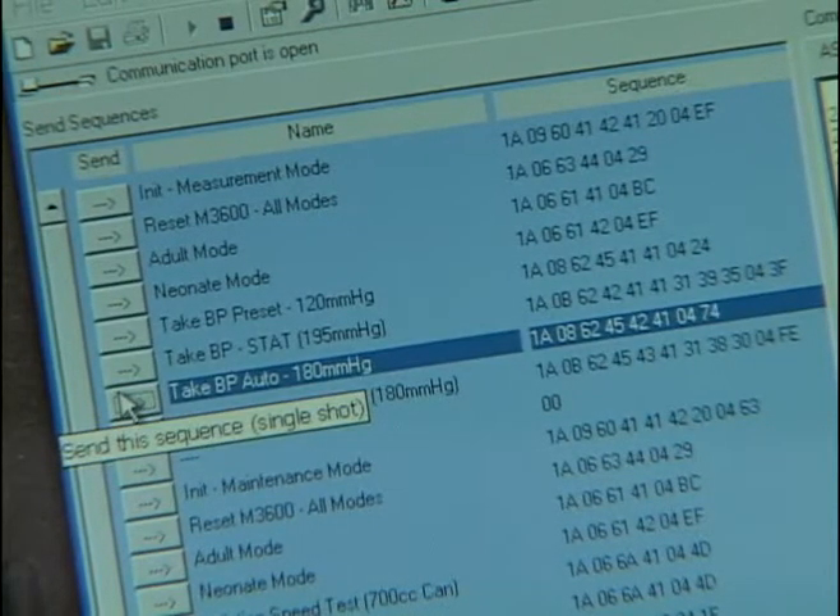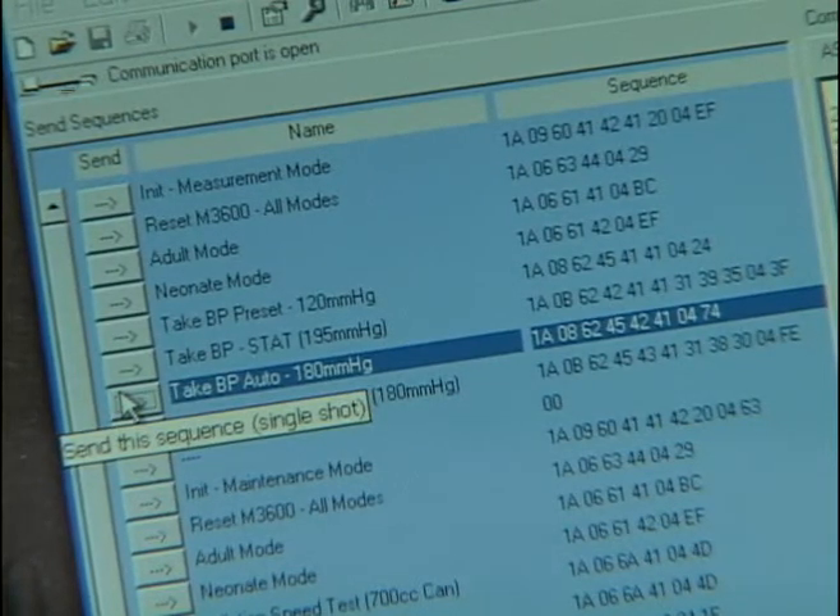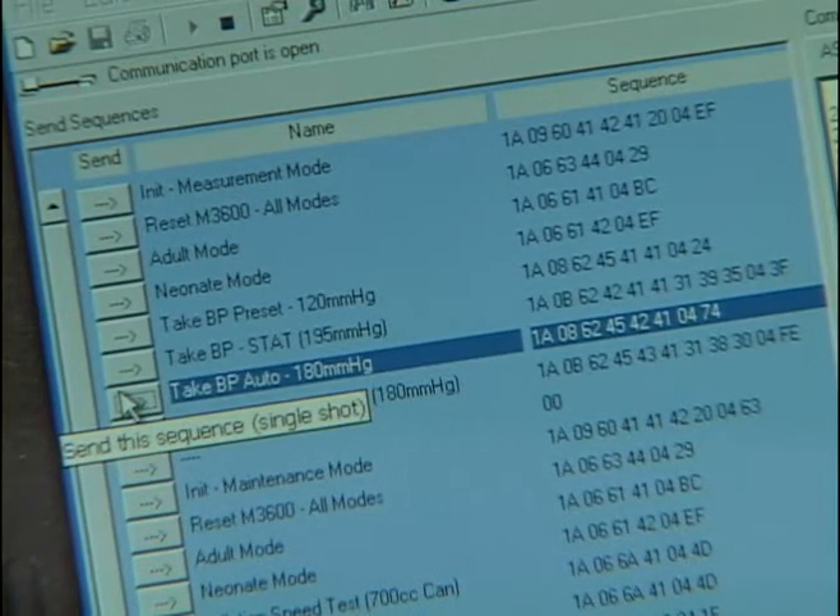In this example, we're going to inflate to 180 millimeters of mercury and then deflate. The data will return the actual measurements from the module.